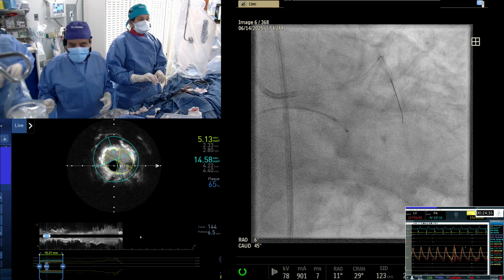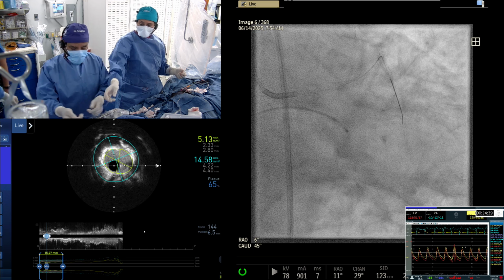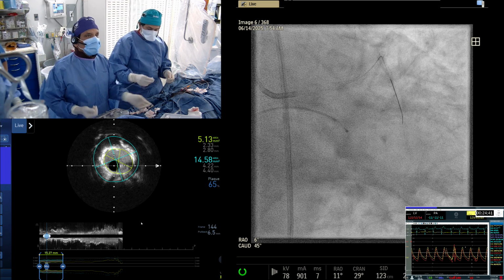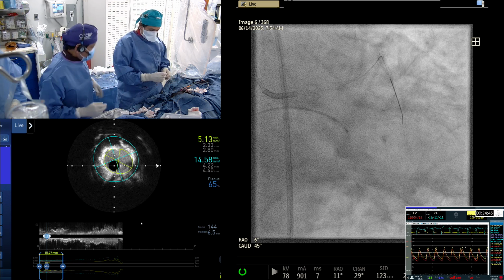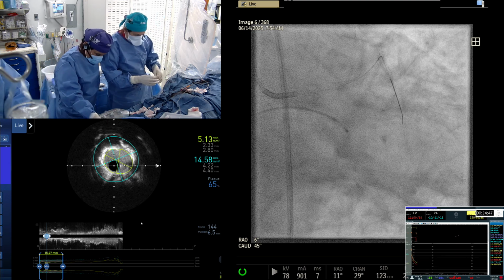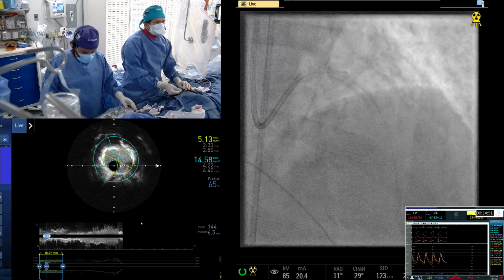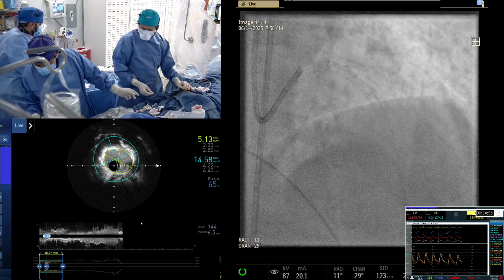Oh, we had it before. Okay. All right, hemodynamically the patient is tolerating. This is the area you can do now on the stent boost. We never took a cranial picture. This could be that. Okay, take a picture. We'll do 1 second.